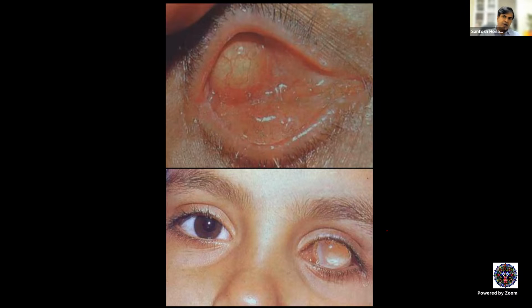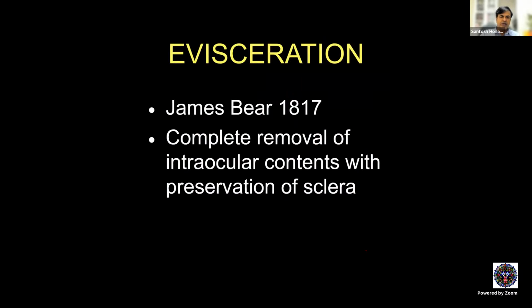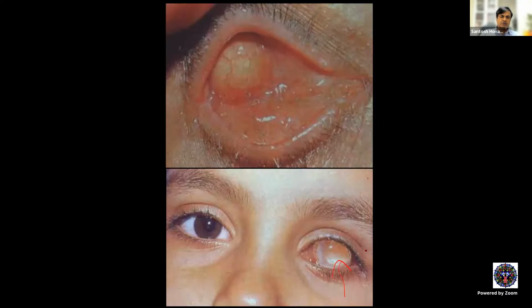And more importantly, if your suturing in 3 layers is inadequate, or if you have not placed the implant posterior to Tenon's, migration is a possibility. Larger implants also extrude. The reason for this implant to extrude is because this child has received a 22 millimeter implant, which is far larger than what he deserves. All right, so that's the end of enucleation.